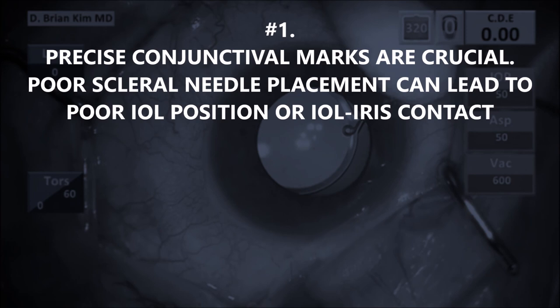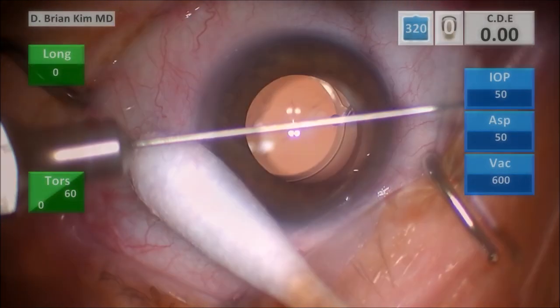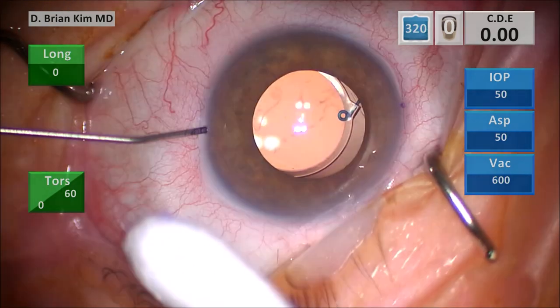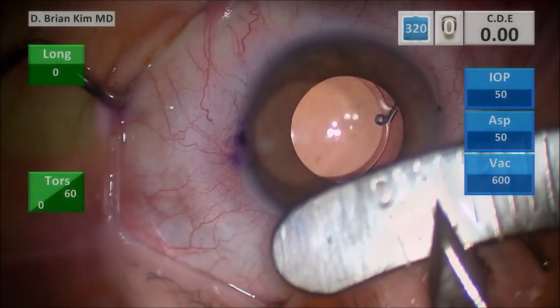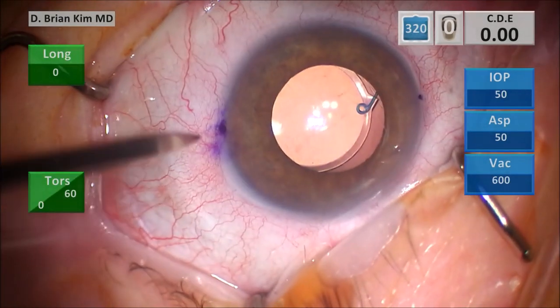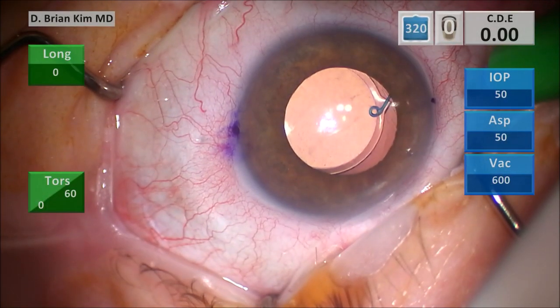Pearl number one: precise conjunctival marks are crucial. Otherwise, you can have poor scleral needle placement, which can lead to poor IOL position or IOL-to-iris contact. It doesn't make sense when you do the difficult maneuvers, finally pass the haptics through the needle, put it into place, cauterize the ends, and the lens is tilted, decentered, or rubbing against the iris causing UGH syndrome. So here you can see this patient has a dislocated lens. I'm marking the limbus using the tip of the cannula, then using the cannula itself to find 180 degrees apart. I use a cotton tip to steady my hand, dry the surface for a more precise mark, then use the caliper to mark two and a half millimeters posterior to the limbus on either side in radial fashion, and then two millimeters adjacent.